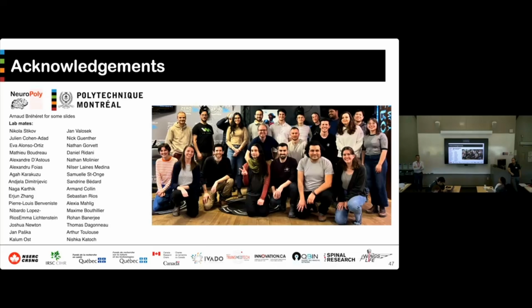Also, maybe something to brainstorm with the whole community here: Alex has been presenting real-time shimming with the signal from the bellows, and we clearly highlighted the limitations of the bellows, including the clipping and the processing done under the hood by Siemens. So I'm really interested in looking at the navigator as a surrogate for breathing pattern. That's something we might want to investigate as well.